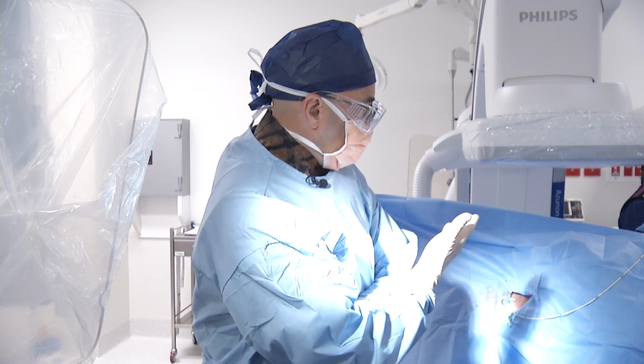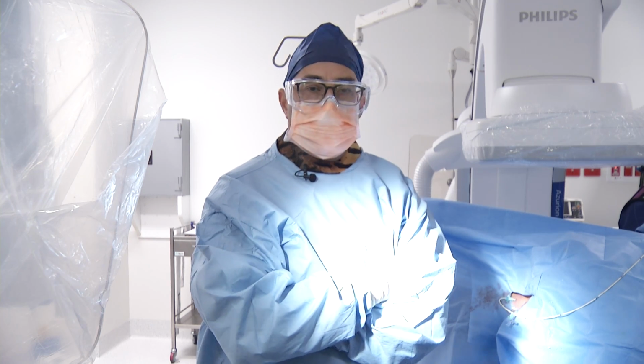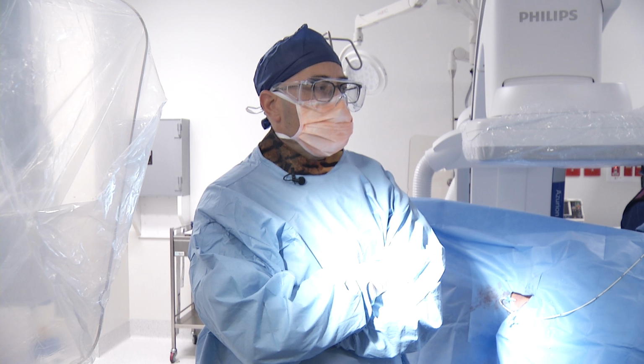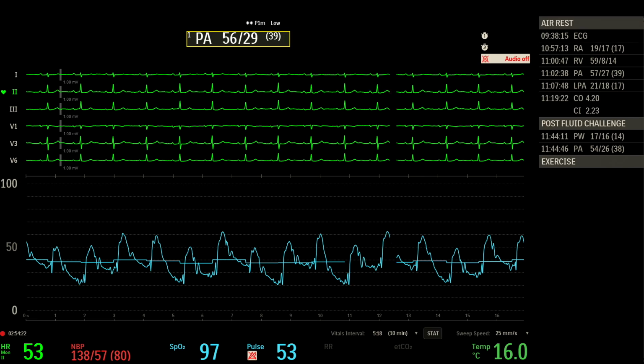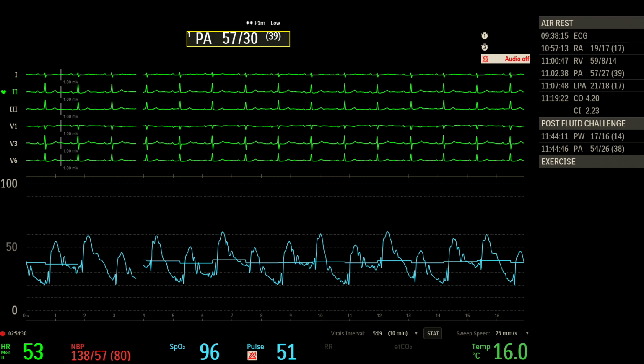We have connected the adenosine to the patient's left arm cannula, and we will now perform a pulmonary artery pressure measurement prior to commencement, with normal respiration. Okay, we will now start the adenosine. Starting at 120 mils per hour.